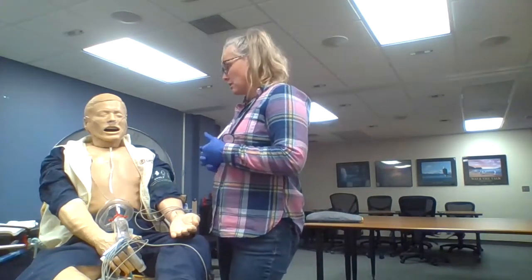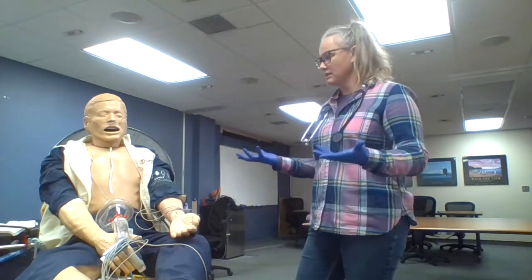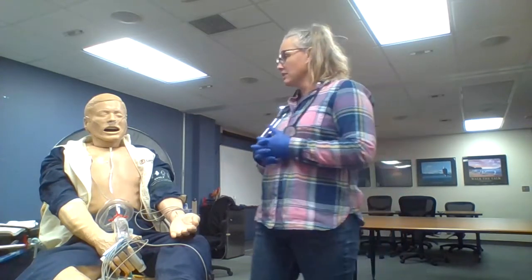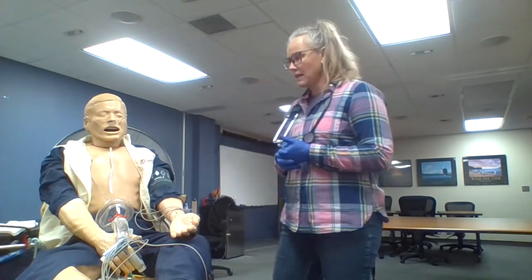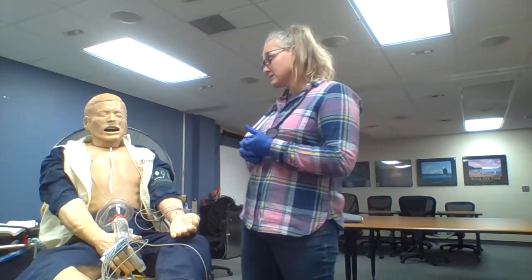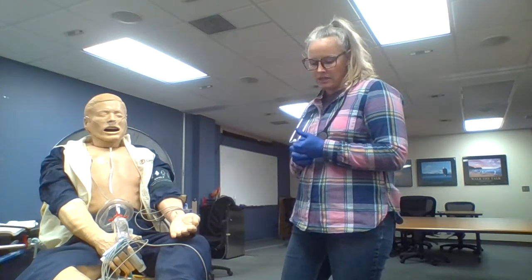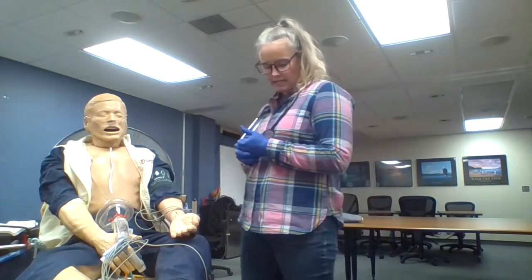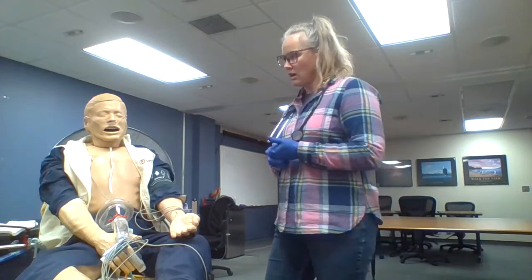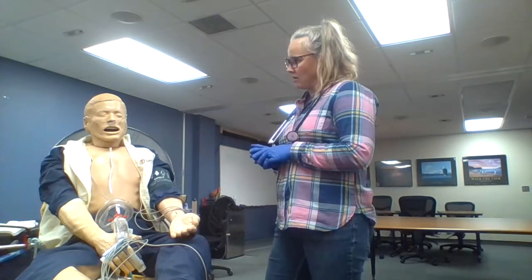And I'm also going to do a blood draw off your IV. From your IV, I'm going to use something called an iStat, and it's a nice little machine that we have here that we can look at a lactate to see how your infection is going. We can look at your electrolytes to see if you have an electrolyte imbalance. The biggest thing we can look at is your blood gas. We can see how you're doing with your carbon dioxide and your pH with regards to your respiratory status. And then I do have a fancy cartridge where I can really rule out, in the moment, cardiac stuff with the troponin I cartridge. So we're going to do all of those tests on you here now, if that's okay.